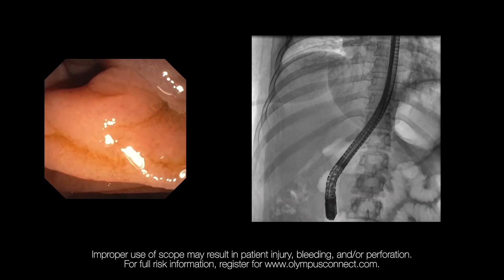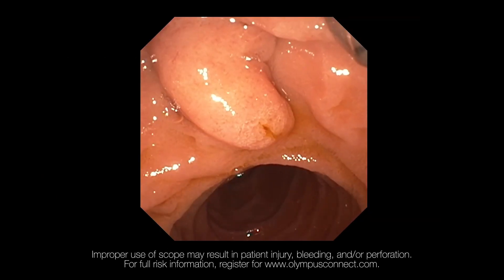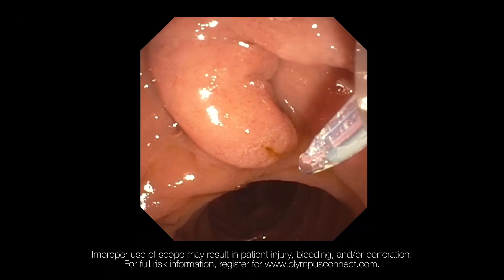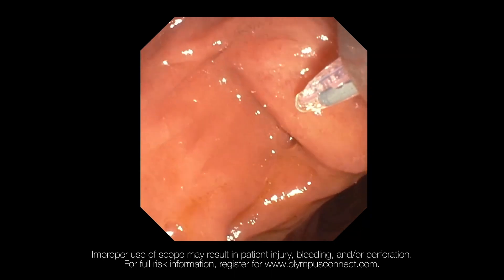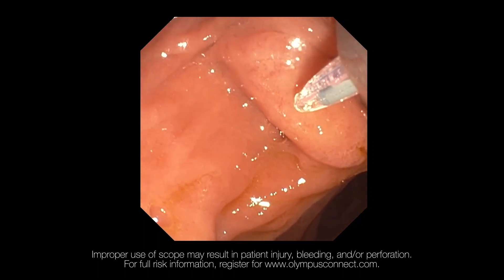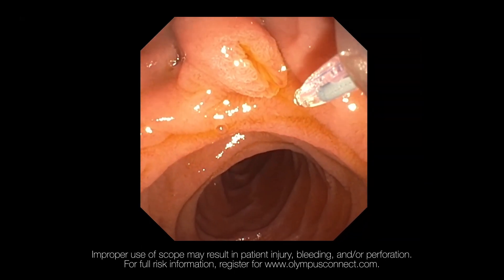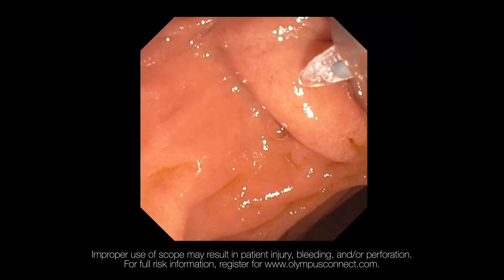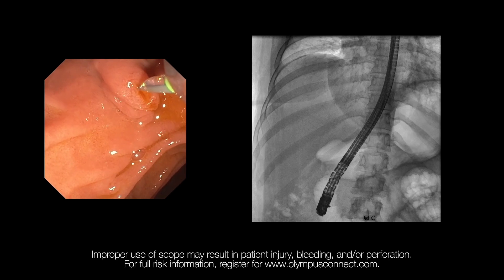It is important to know where the papillary orifice is. It is equally important to know the rest of the shape of the papilla — is it bulgy, is it flat, how many folds are there, where does the papilla meet the duodenal wall? Then I draw an imaginary line from the papillary orifice towards the center of the papilla where it meets the duodenal wall. This imaginary line determines my axis of cannulation.